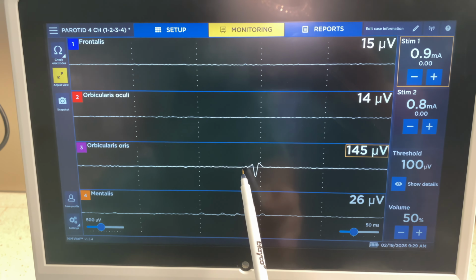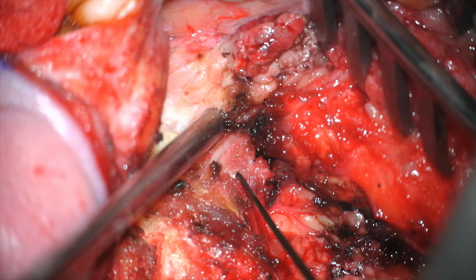And look at that 1.5, right under the 1.5, that number changes to 1.5. You see? Because that tells you the current that's being delivered. And that short burst is telling you that it's connected. This is just a band of tissue and an artery. You see? Look, this vessel. So this is often thought of as the nerve. And it's always here. So that's the first thing that's not the nerve. Okay? Now, I told you it's going to be a rough spot.